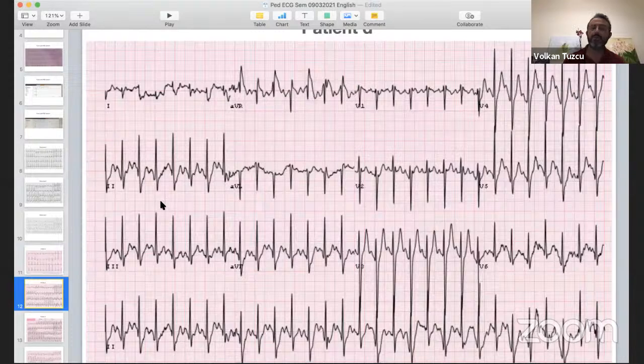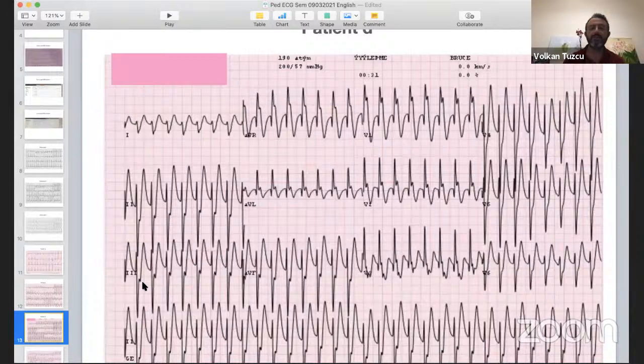Here, again, just a normal looking exercise, peak exercise or whatever. As you see, there's J-point depression, but nothing pathologic. Still sinus, still acceptable. But suddenly patient goes into this, the QRS, everything changes, right? So how do you interpret? This is a patient exercising, and the rate up here is 190 beats per minute. So what do you call this rhythm? Okay. Is this SVT? Is this ventricular tachycardia? So how would you define it?